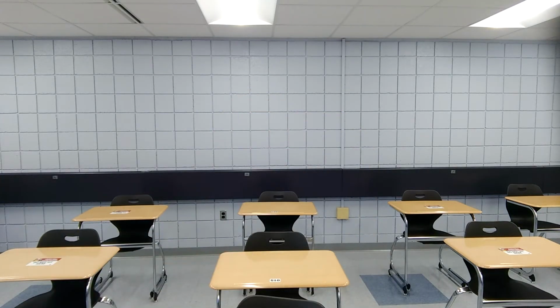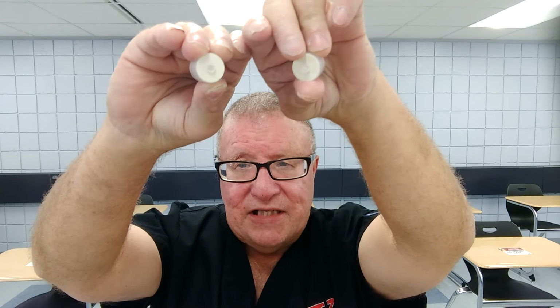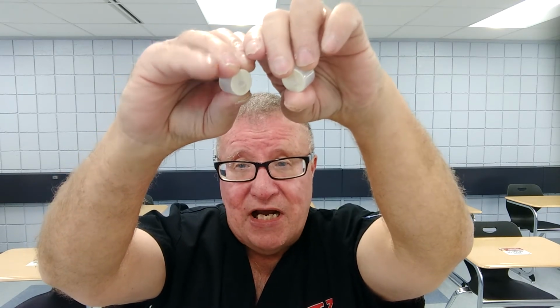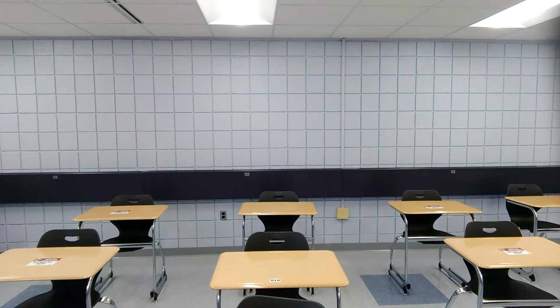Now, these are what it looks like. These are the two one-way valves that are in there. Now, in order to do a NIF procedure, you have to take these valves out because you don't want them to be able to breathe any air in. You make it so the valves are positioned on either side, so when they suck in, they can't get any air in, and it goes to the monitor and they can measure it. Again, it takes a little bit to get used to.